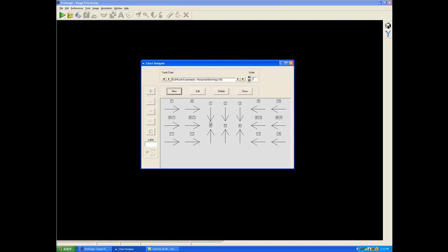So again, the wire is attached here, here, here, here, and so forth, here and here, and it's always, the wire in this case is going this way. Over here, the wire is moving this way towards the front of the mouth, down and up. Up from the bottom, down from the top, out the front of the mouth.